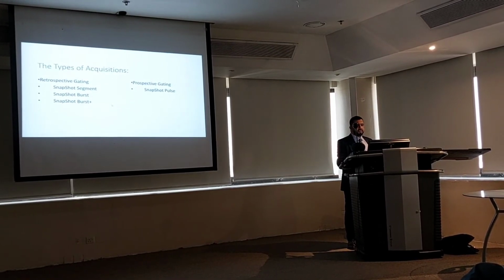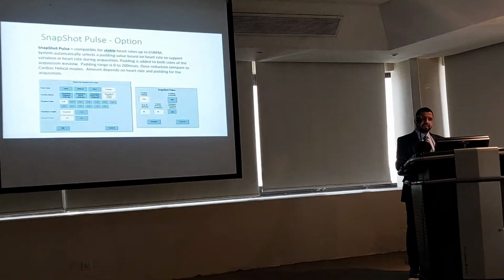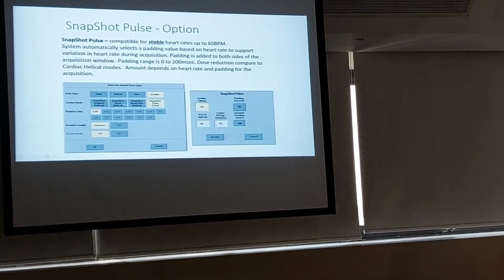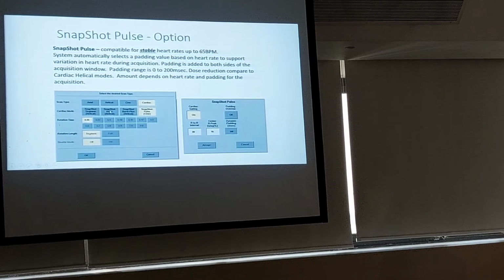Segment, burst plus. While we have only one, I will show you this one. This is the pulse, the prospective gating. This is the only prospective one. These 3 are helical retrospective gating.